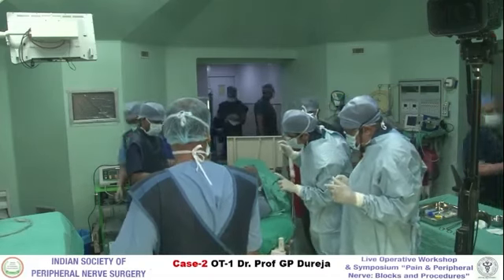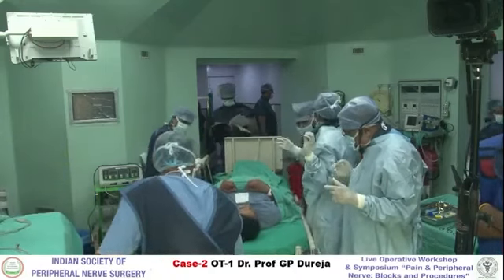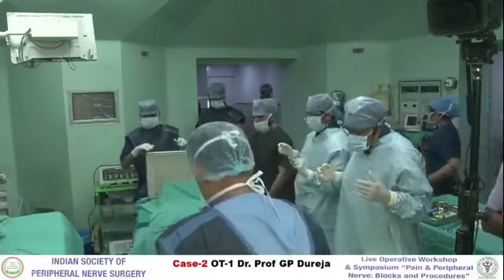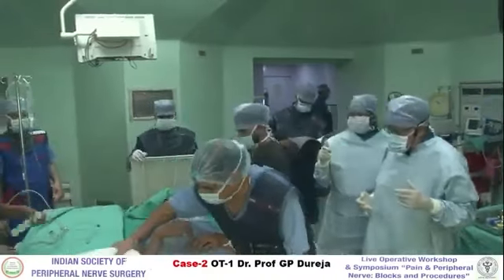Okay. Failed back syndrome case. Yeah. Okay.